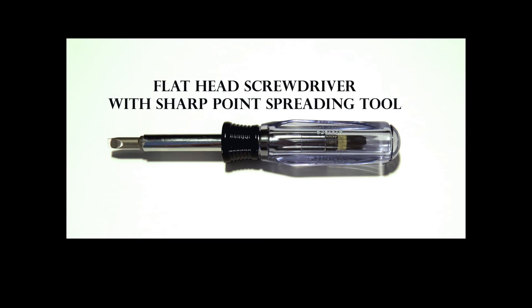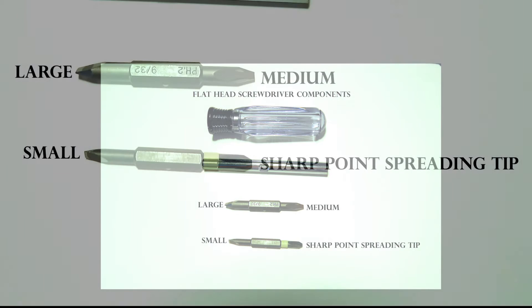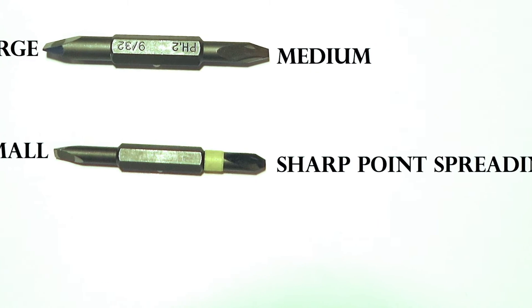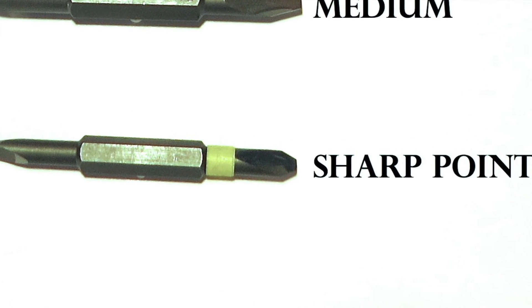Screwdriver Spreading Tool: This screwdriver is used to tighten large and small screws that are found to be loose. It has a reversible shank and three sizes of flat heads to fit most screws. It also has a sharp pointed tip that is identified with a colored band, and it is used to spread the tip on ring and tissue forceps.